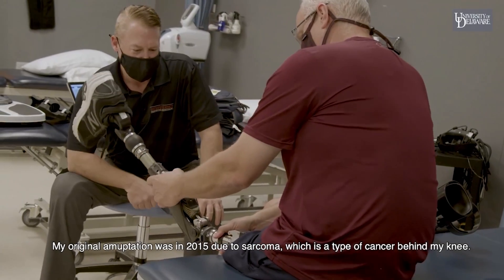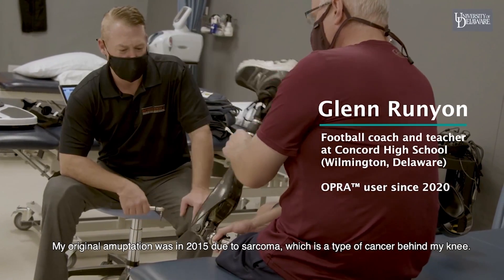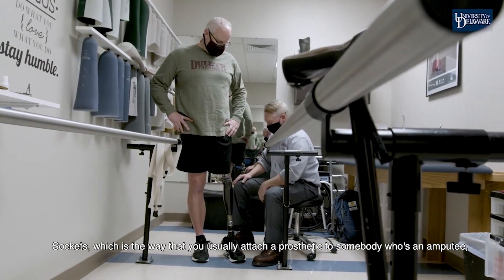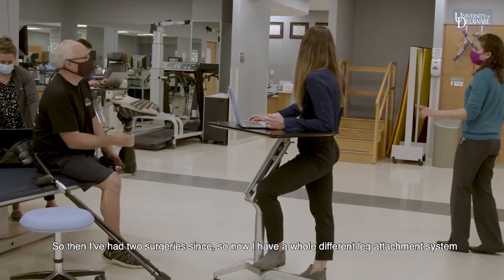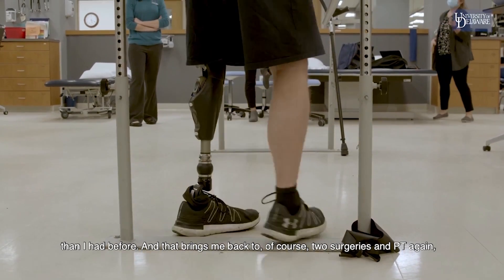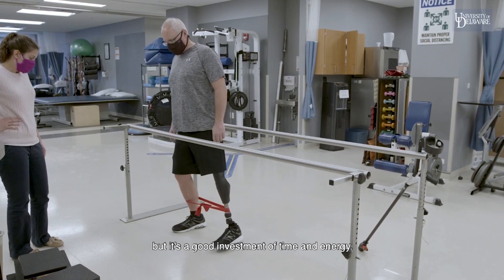My original amputation was in 2015 due to sarcoma, which is a type of cancer behind my knee. Sockets — the way you usually attach a prosthetic to an amputee — weren't really working for me because of the shape and size. I've had two surgeries since, so now I have a whole different leg attachment system. That means two surgeries and PT again, but it's a good investment of time and energy.